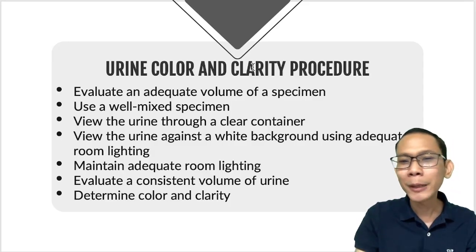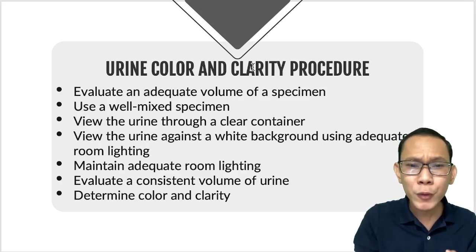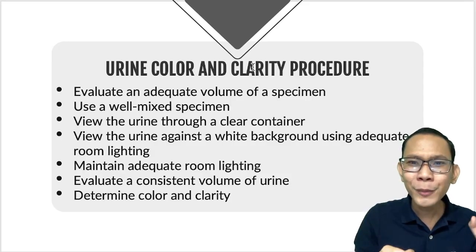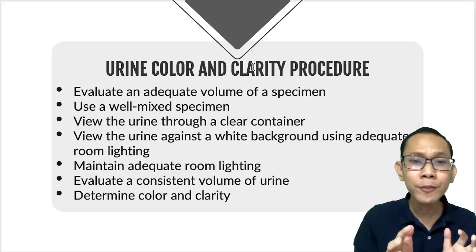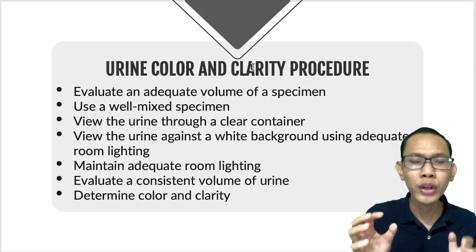And later on, there will be a confusion in your result because you reported the sample to be clear. But then again, when you do your microscopic examination, you were able to identify a lot of different sediments, crystals, and whatsoever. But your physical examination, it seems that ang nakalagay doon is clear. So that's why there could be now a confusion. It is very important that there should be a proper, correct way of reporting your physical examination. Dapat tumutugma din siya sa ating microscopic examination.